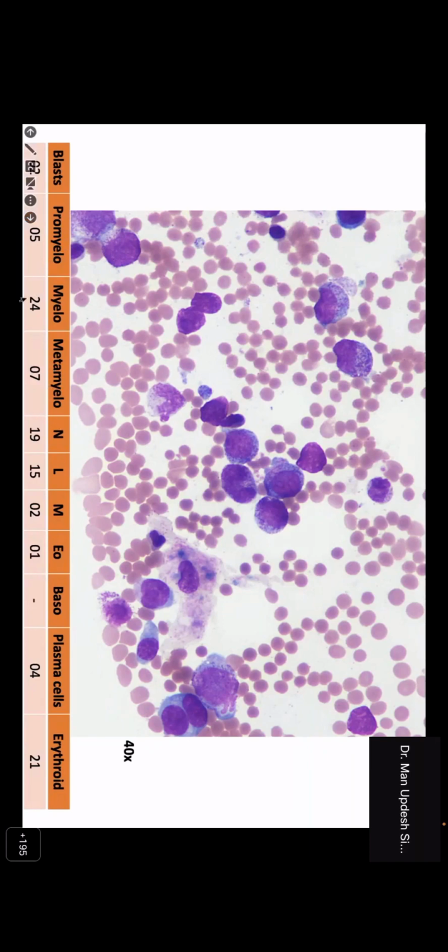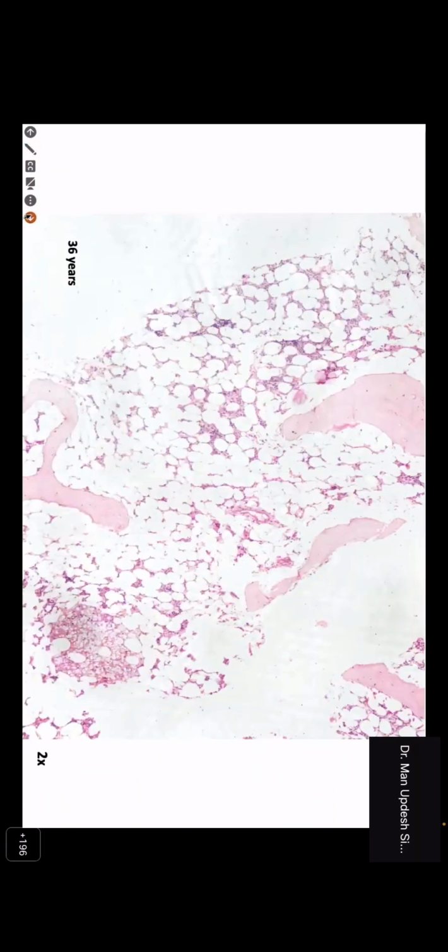There are enough granulocytic precursors, myelocytes and neutrophils, which should be around one-fourth to one-third of the cell population in a bone marrow. It's slightly on the lower side. Lymphocytes are okay, and plasma cells less than a few percent would be okay, but they were prominent in some places. In counts, they are just 4%. Erythroids are normal. So that's the differential, and we go to the biopsy. And again, Tarun Jyoti, what do you see at this low power?